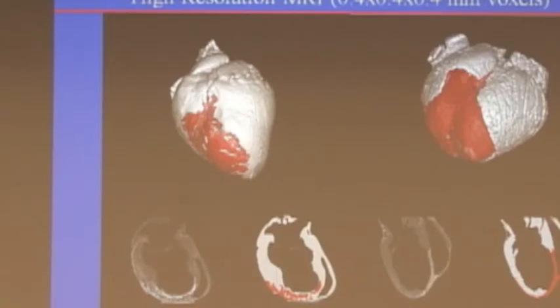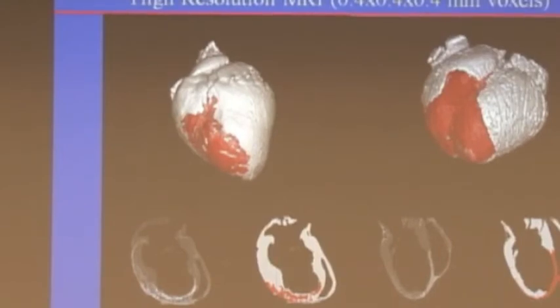Yeah, I'm just wondering, when you define gray zone, is that a standard based on what intensity you see in scar versus healthy tissue? That's a great question. There's actually no standard, and you can alter it considerably. What we do, our particular definition, is we usually use 2 or 3 standard deviations above the dark part as the gray zone, and then some more standard deviations above that is the white part, and the stuff in between is the gray zone. There's lots of different ways.